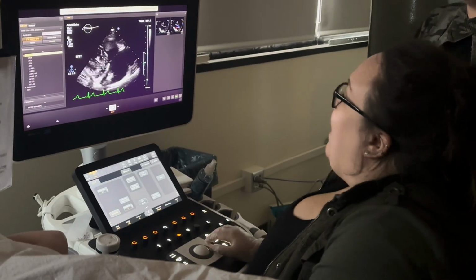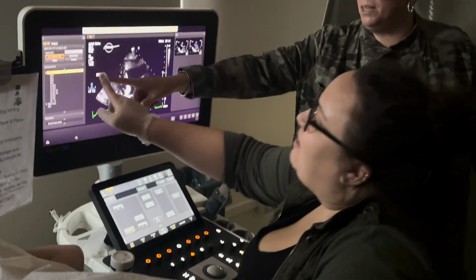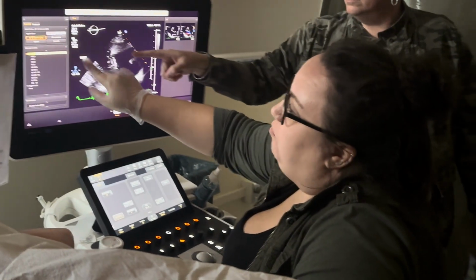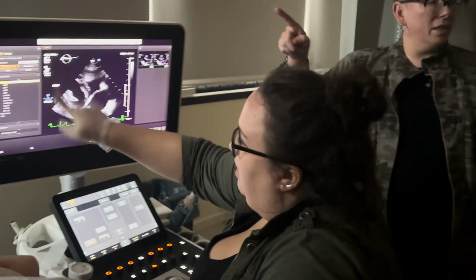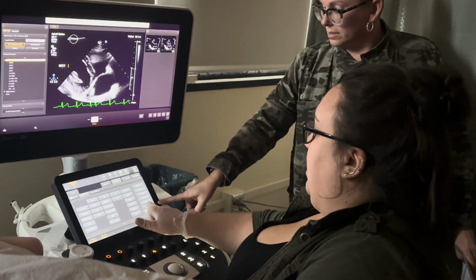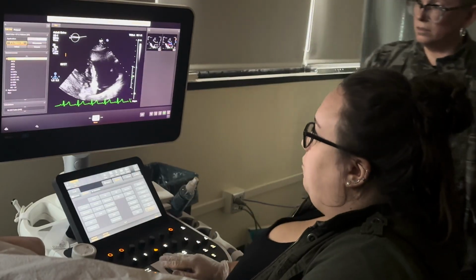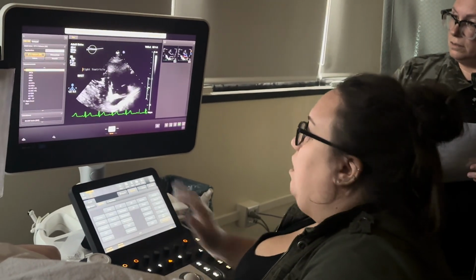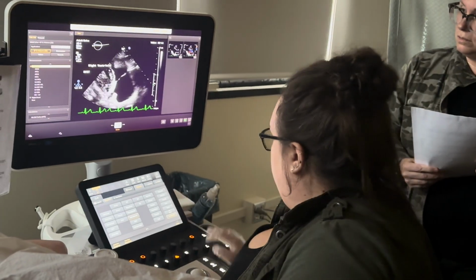You can set home. Notice how it kept wanting to default to writing down here. I set its home to up here, so now whenever I type something, it'll stay up there. So I have label, and then I hit set home. You put your cursor wherever, hit set home, and then look, it wrote there.